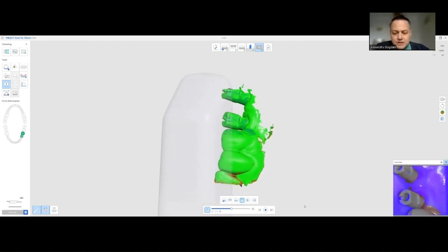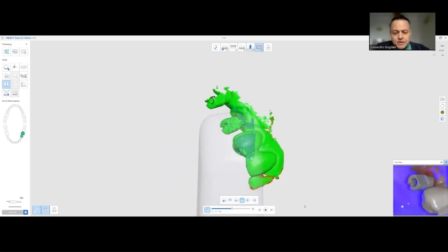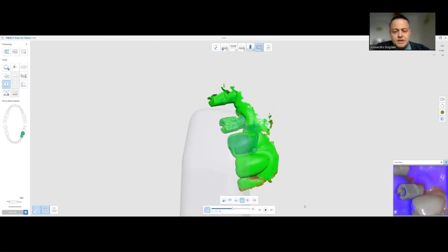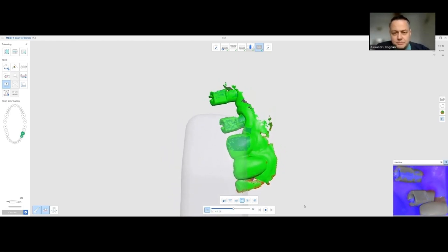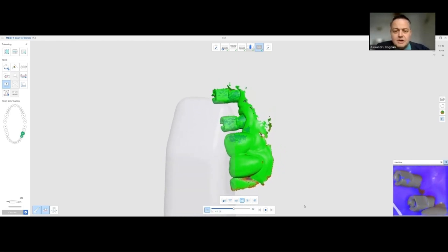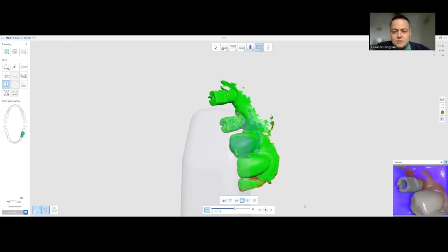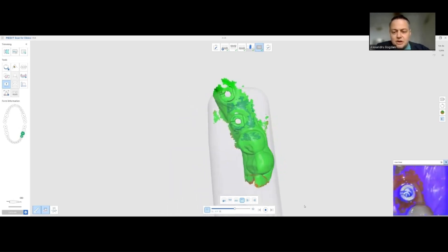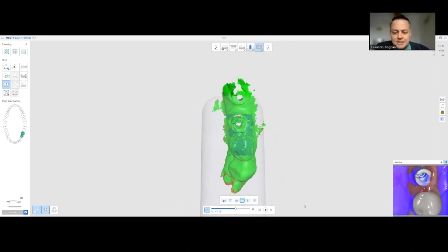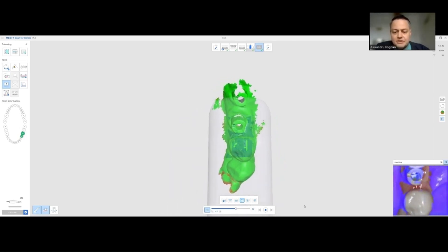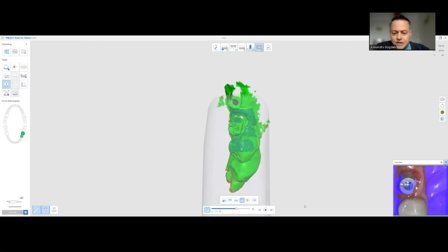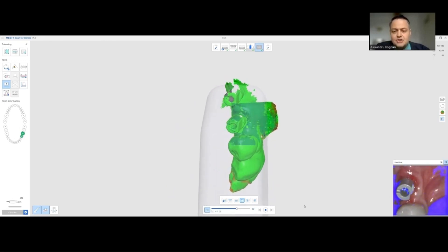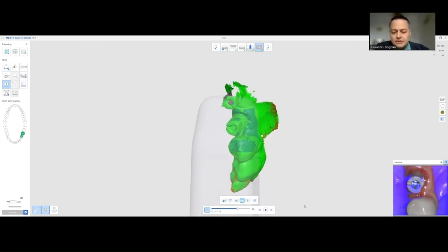What I want you to see here is that we use the HD function for imaging this part, for imaging the scan bodies, because they have the flat parts and the angles that are much more correct.